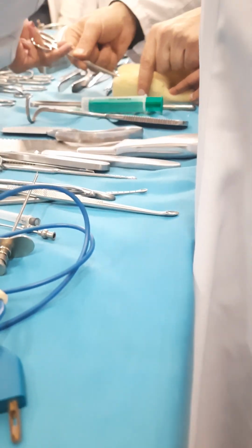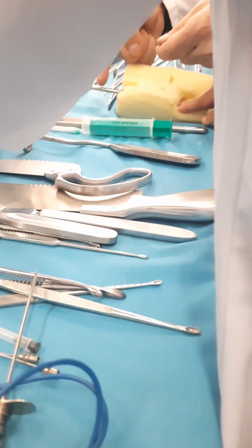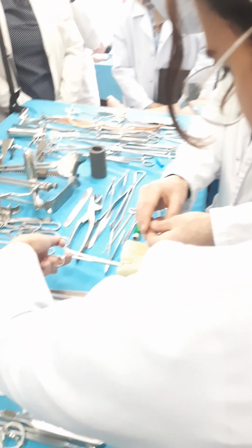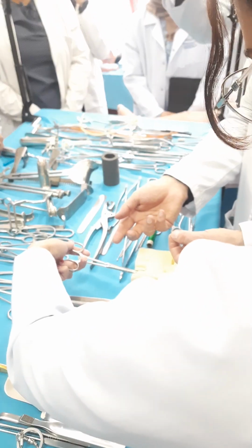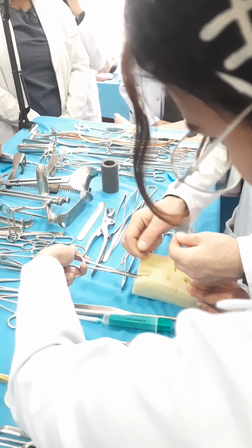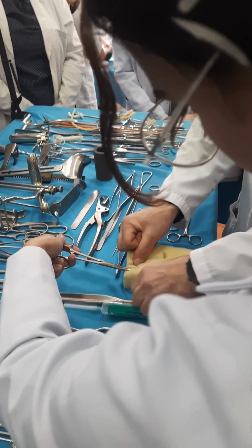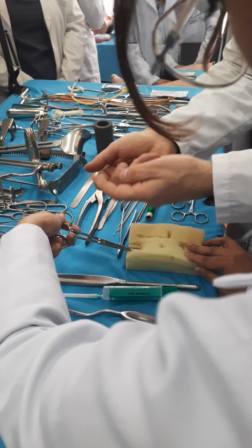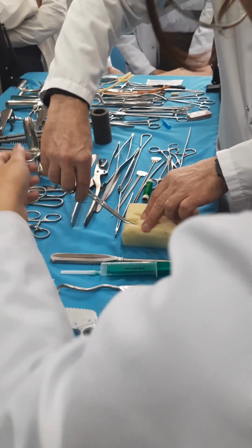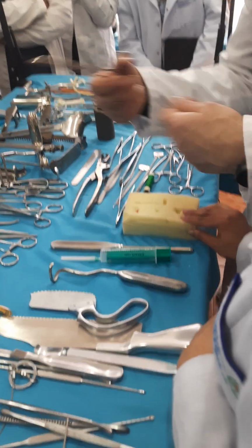Look, friend. Then I start to ligate it. You must show me the tip of the instrument. If you will not show the tip, I will apply my ligature on the instrument, not on the sponge. Sponge is some tissue, doesn't matter which one. Now look, I make the surgical type of knot. First, my manipulation, I do twice. After I will show you the type. And now she shows me the tip, I tighten maximally, my thread is very weak, so it is disconnected. But anyhow, I think you understand. After this, she opened her instrument, removed it, and I finish my knotting. I make a second knot, third knot, fourth knot.